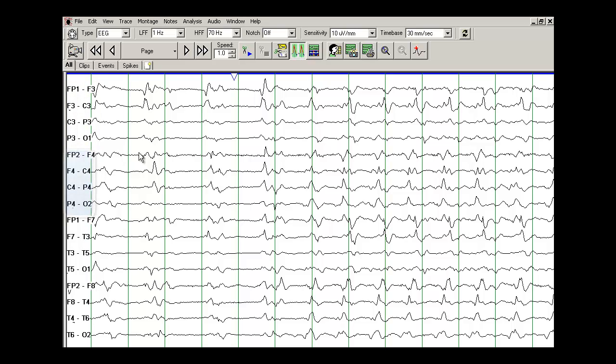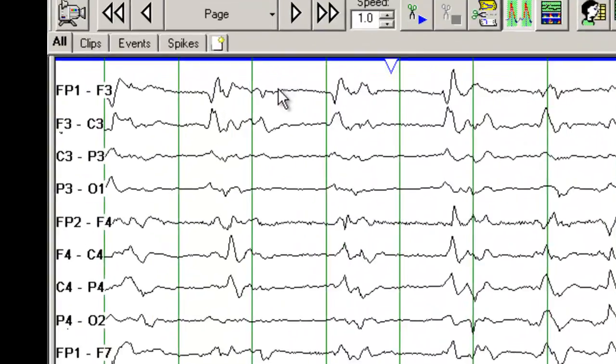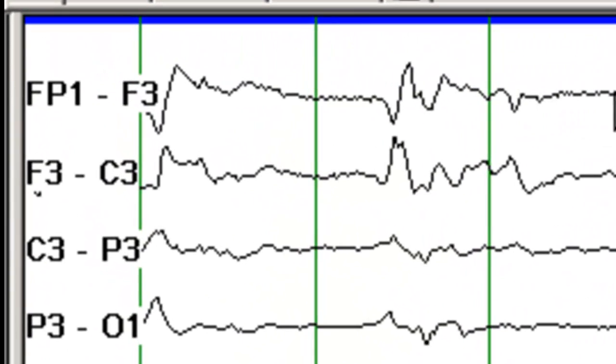This EEG does not have the normal organization where you see beta frequencies anteriorly and alpha frequencies posteriorly.